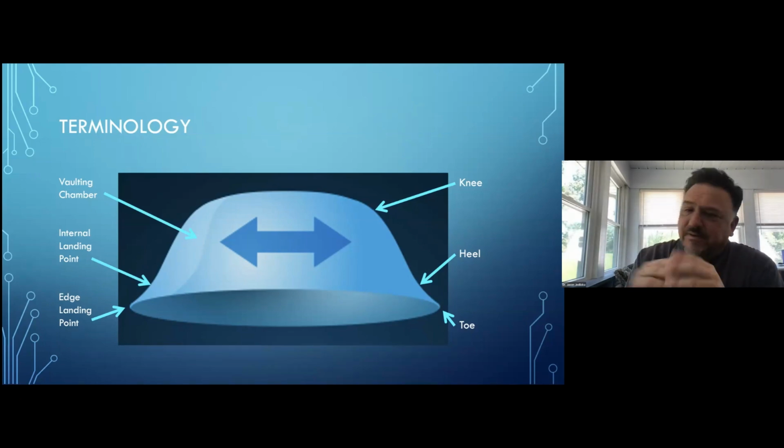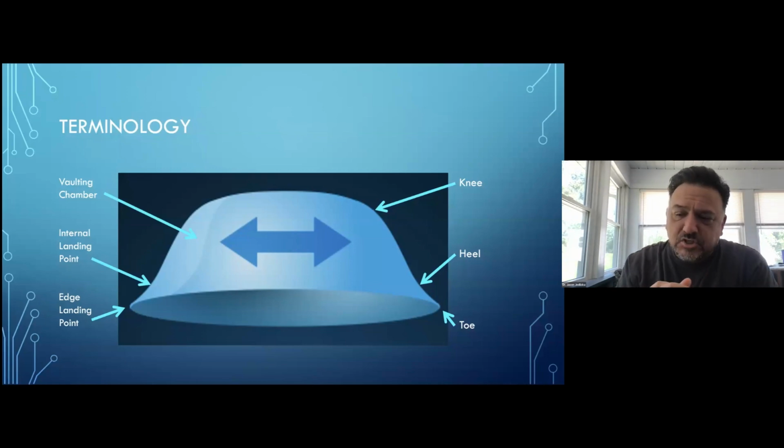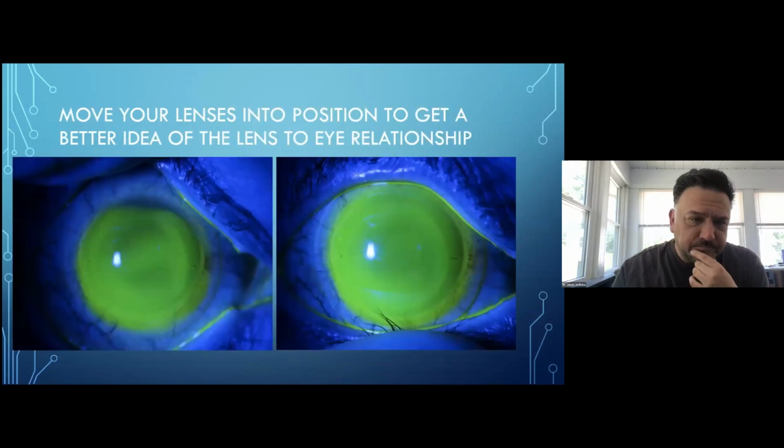And then we've had this concept of our heel and toe, on our edge. And I think that's valid. We want an edge that lies down nicely with the heel and toe both in alignment. We also want to contemplate the idea of the knee of the lens. I think we're going to find as we go forward more and more lenses that are being built with internal toricity capabilities. I know that's absolutely happening. I think that getting the entire heel and toe of the lens to fit to the eye shape completely requires internal toricity to bring that into fruition.